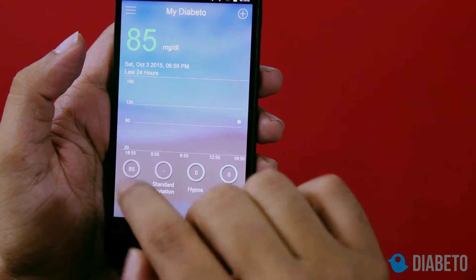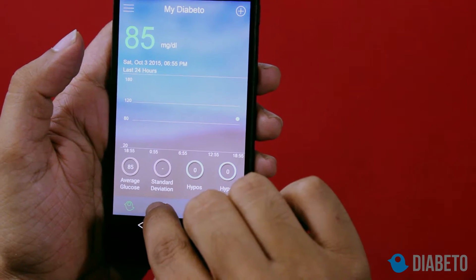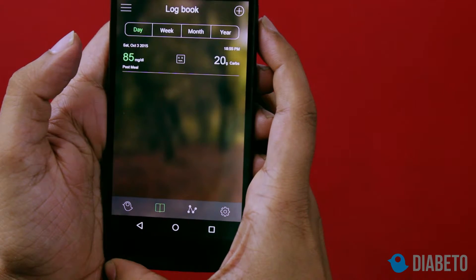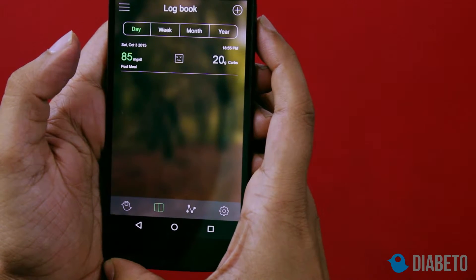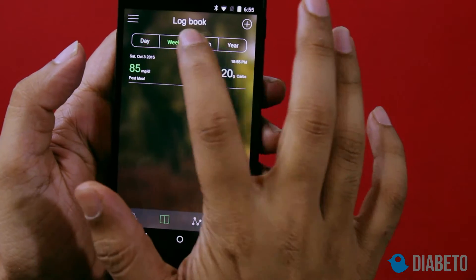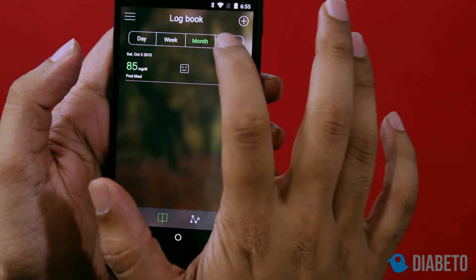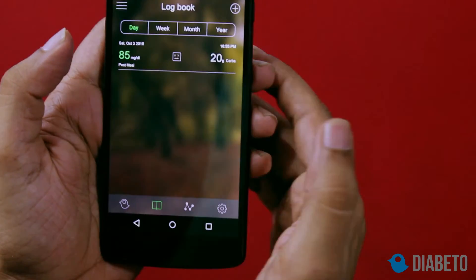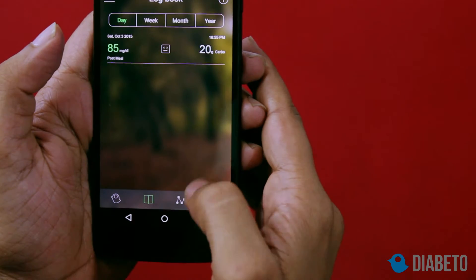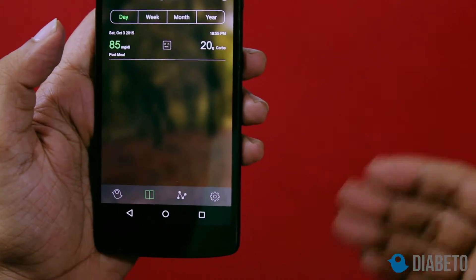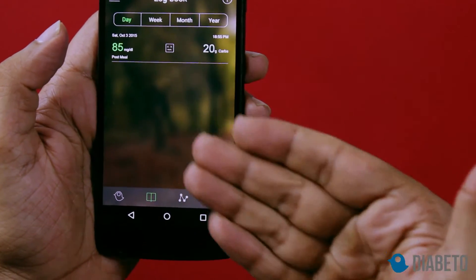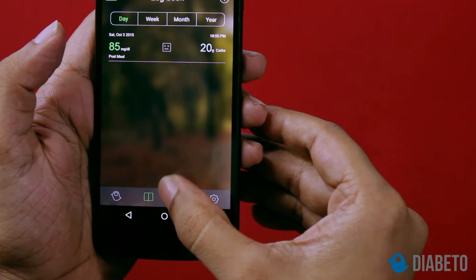If I go onto the logbook, the logbook simply shows your readings for the day, week, month, and year. Obviously this is my first reading so it's just showing me that one entry. After you start taking more readings, all the entries will begin to appear here.